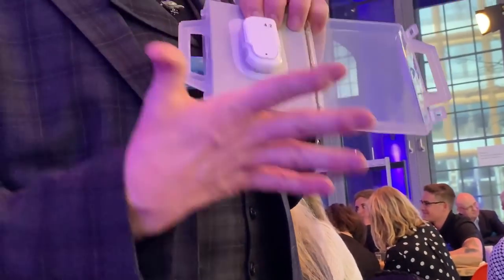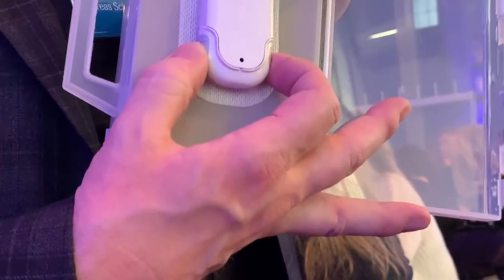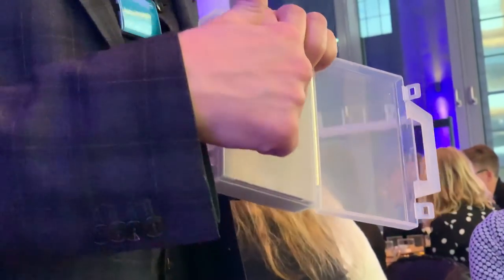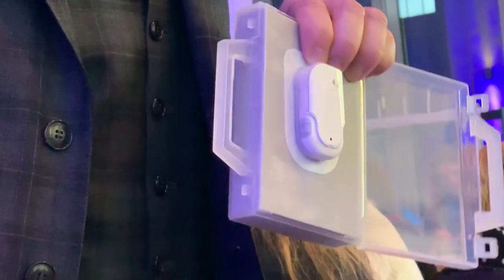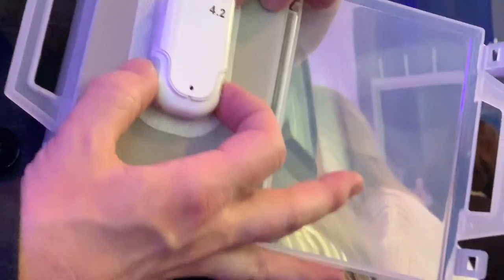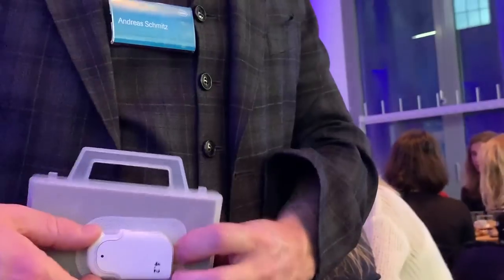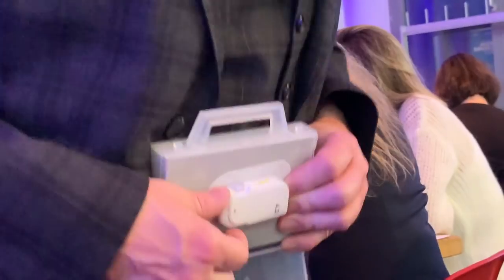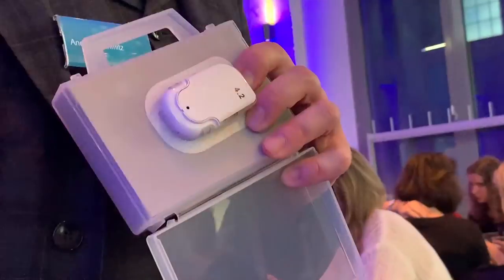Okay, with this pump, you have these two buttons to do yourself boluses. In terms of orientation, there is the sound of it. So I want you to listen when I'm doing it. When you want to use these two buttons, you always have to press both at the same time. That's for safety, because if I wear it, for example, on a belt, there's a chance an object could press on one side, but not on both sides at the same time. Be sure. So let's do it.